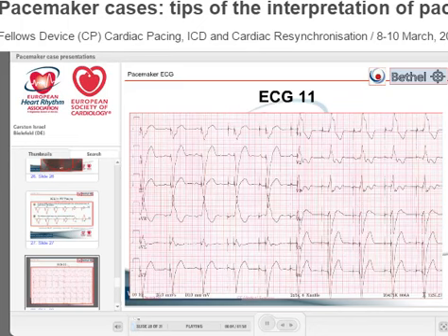One of my favorites. This was a young, no, not young, this guy was around 60 years old. He had had heart surgery for congenital heart disease when he was 7 years old. He had a VVI pacemaker epicardially, and that device didn't work. The lead didn't work. He had exchanges every 2 years because of a threshold of 5-6 volts.